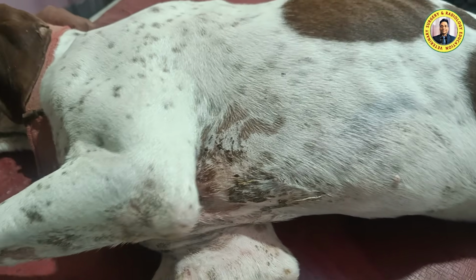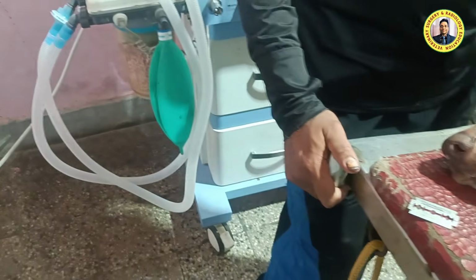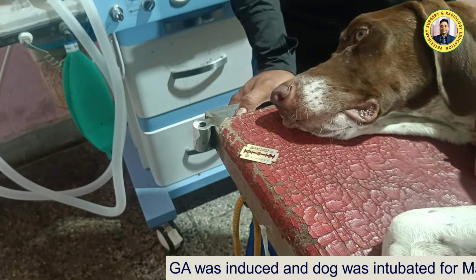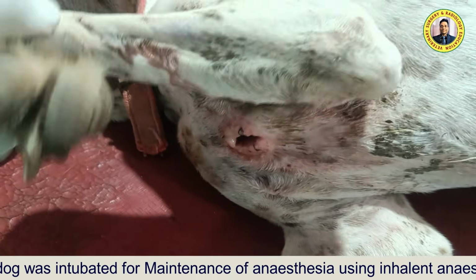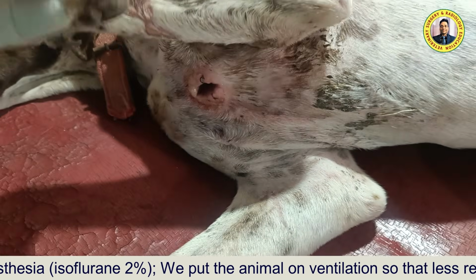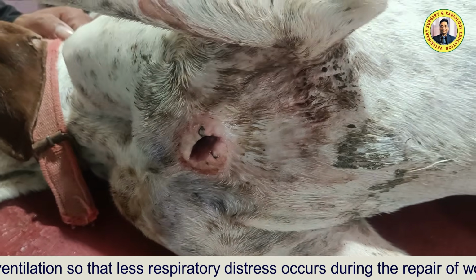Now we are going to intubate, and with the help of this inhalant machine, we inflate the lungs completely, so that whatever air is present in the thoracic cavity will escape through this wound, and then simultaneously we close this wound. Although this is a 3 or 4 day old wound, we applied a nylon suture, that is the polyamide suture material.